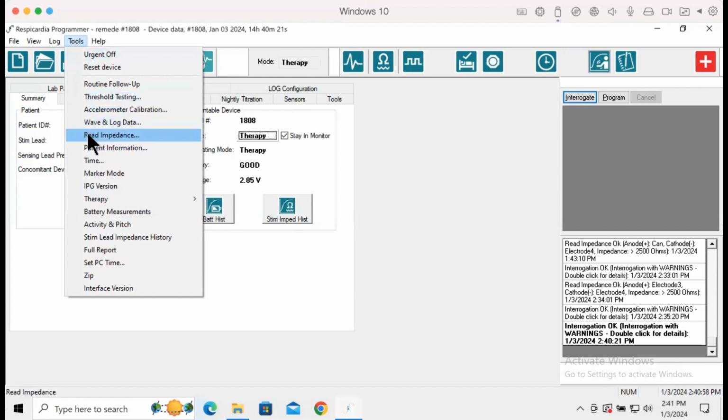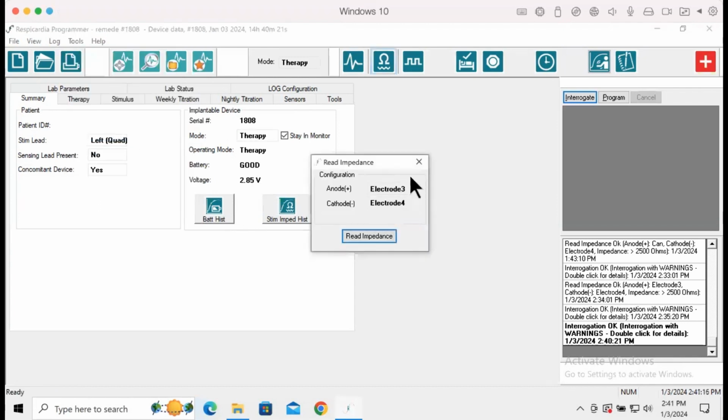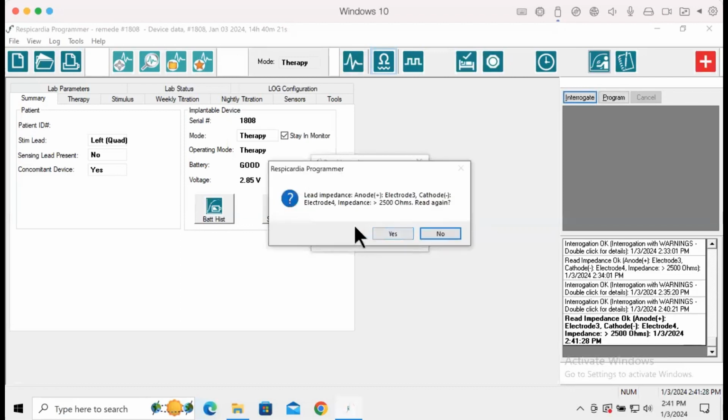The displayed anode and cathode represent the preset electrode pair. You can opt to select any other desired anode and cathode for testing. Simply choose Read Impedance. Upon completion, select Yes if you wish to repeat the test or No if you have finished. Please note that this is a test patient.